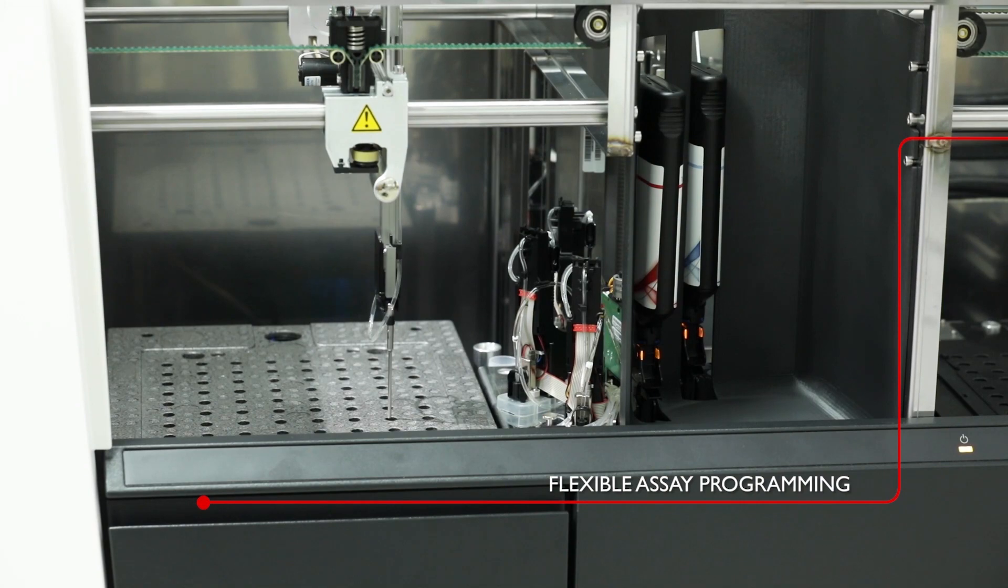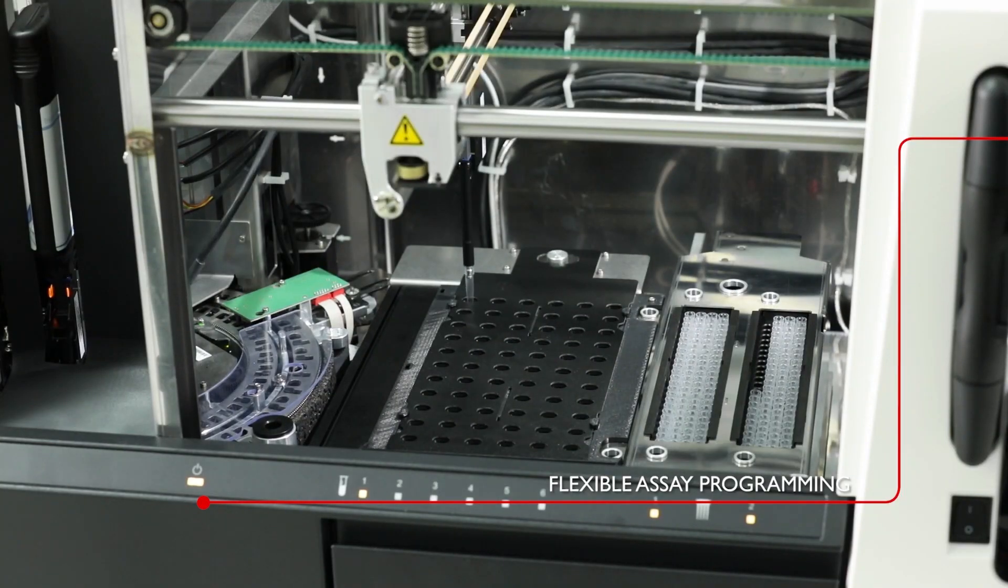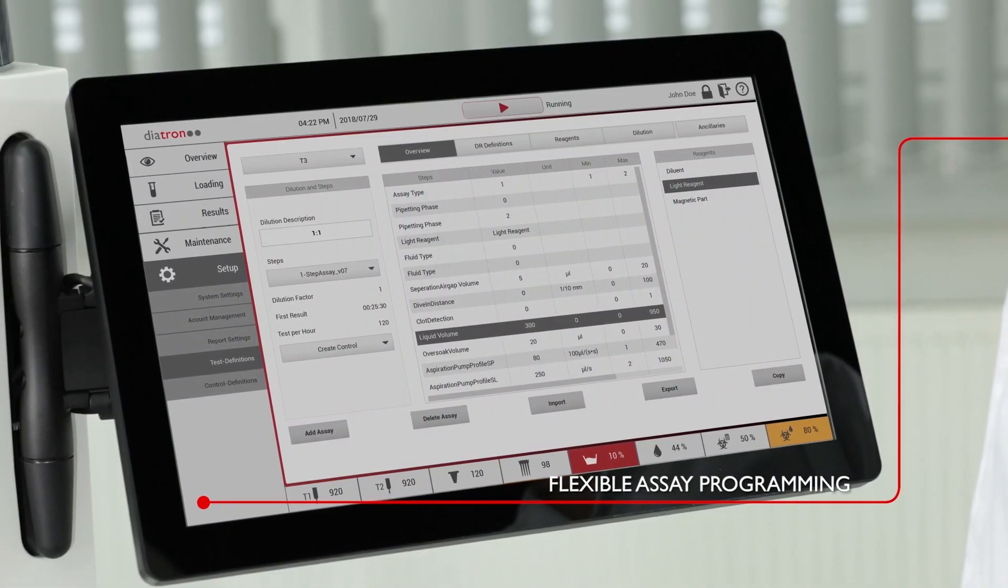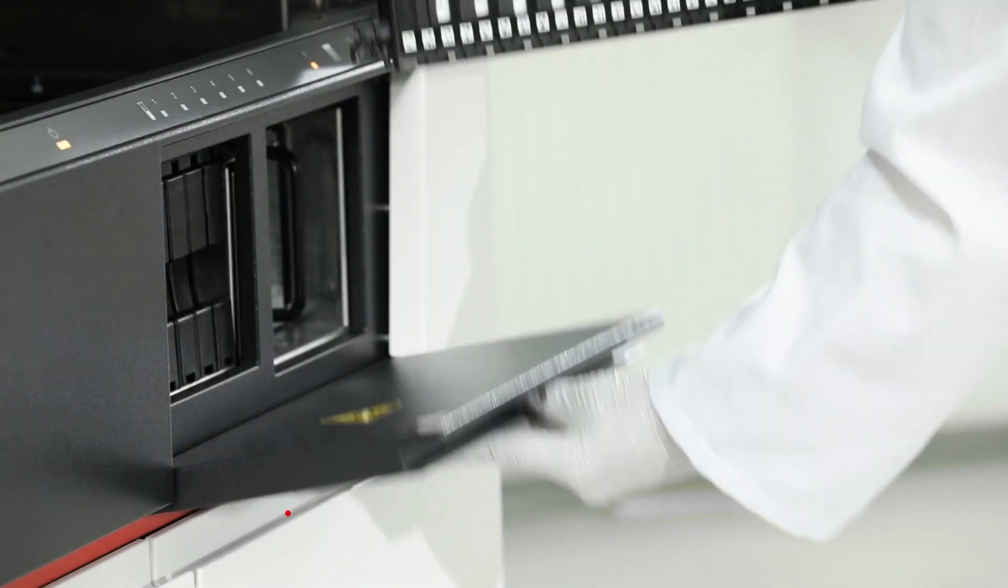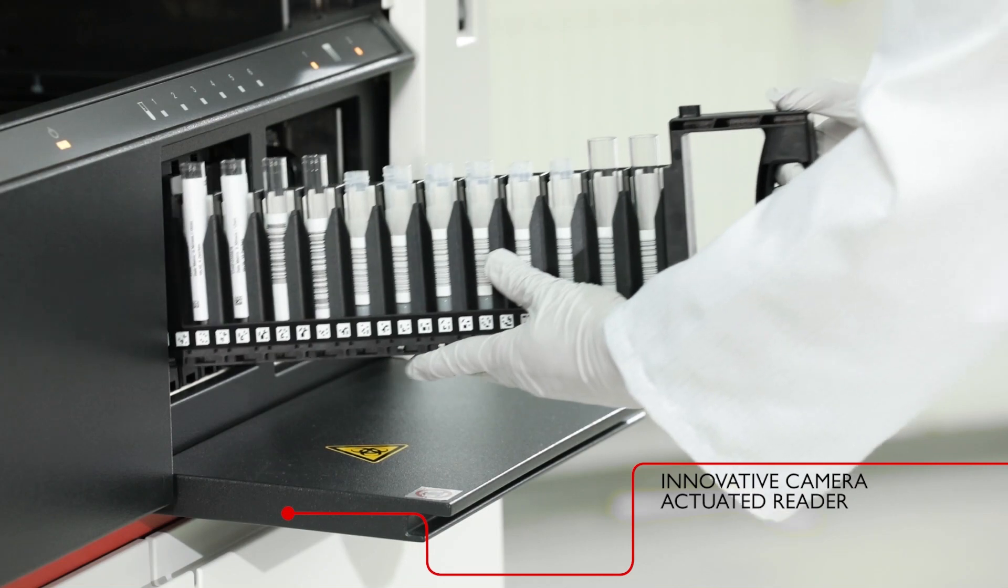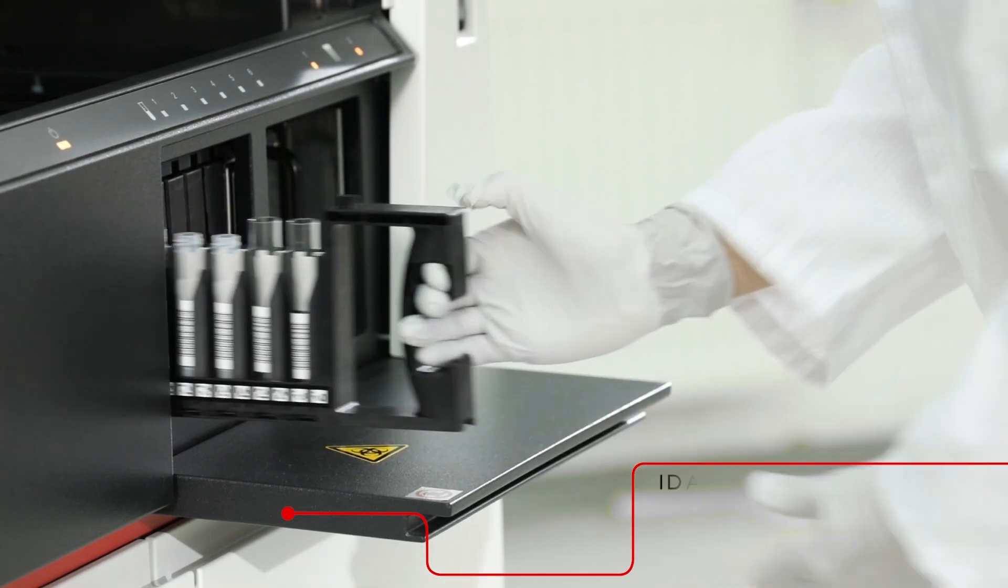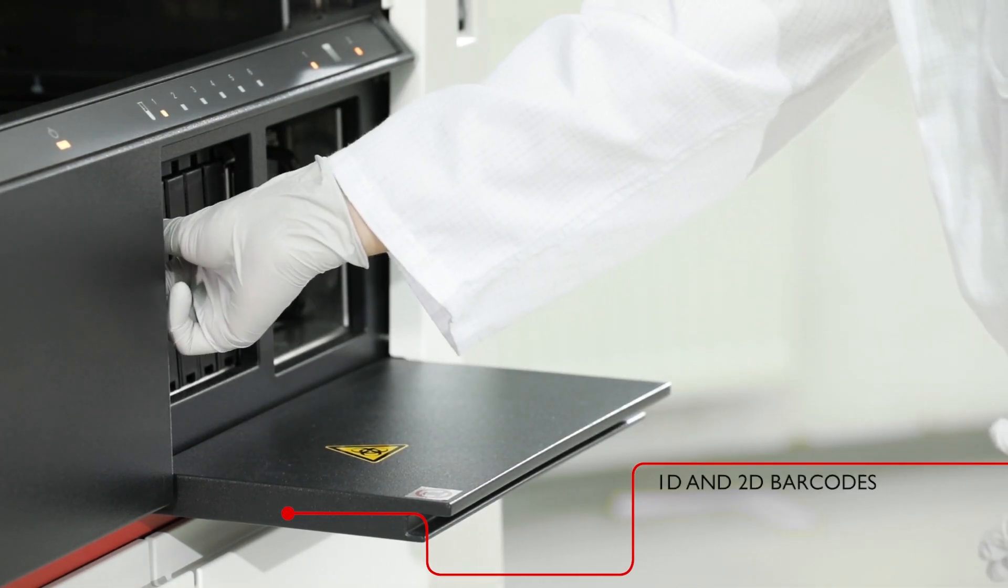Assay developers benefit from a highly flexible system. The test definition editor allows modular assay programming. The camera-based reader identifies both 2D barcodes and the presence of a wide variety of tubes.